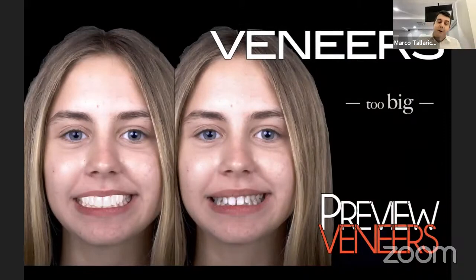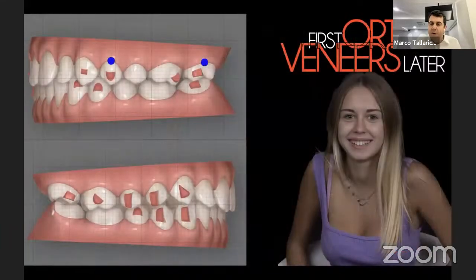With the veneers, the problem is that with veneers without orthodontic treatment, we have two problems. The first is that the teeth are very big because we need to close the diastema. Another problem is that in order to have the veneer perfectly in the midline of the patient, we need to make a very big reduction of the natural teeth because, as you can see in the picture on the right, the middle is not centered. So she's very young, so it's not possible to prepare the teeth. And after this picture, I convinced her to start orthodontic treatment.